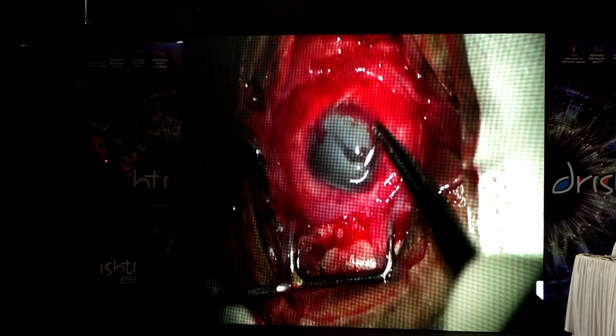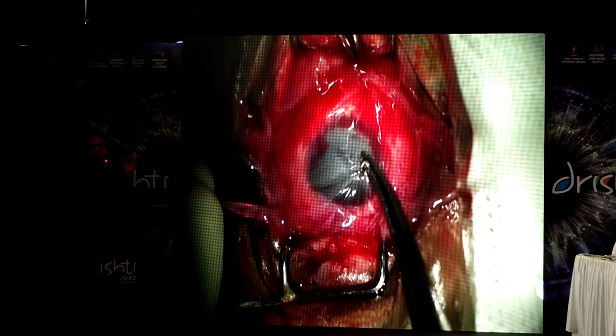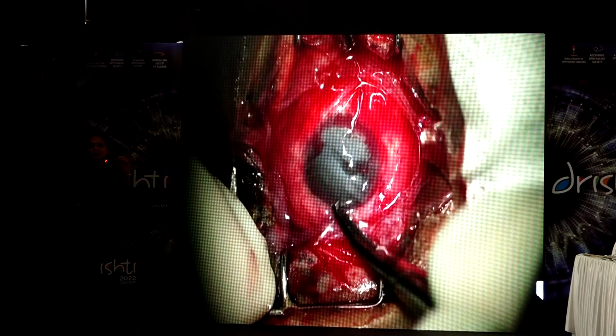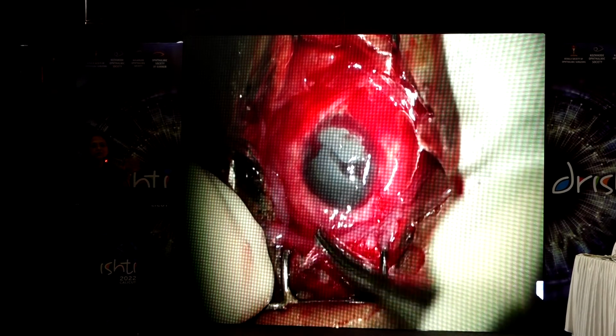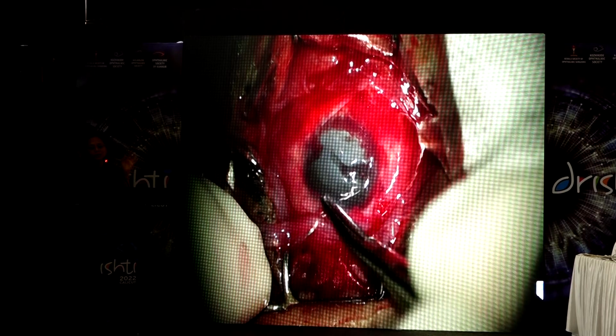So this surgery does take a long period of time, and I always use minimal cautery. Before starting, what I do is adequately pack the surface with adrenaline-soaked swabs. I have plenty of thin cotton wicks soaked with adrenaline, and I place them on the ocular surface, so that helps to control the bleeding as well, and thereby you use a minimal amount of cautery.